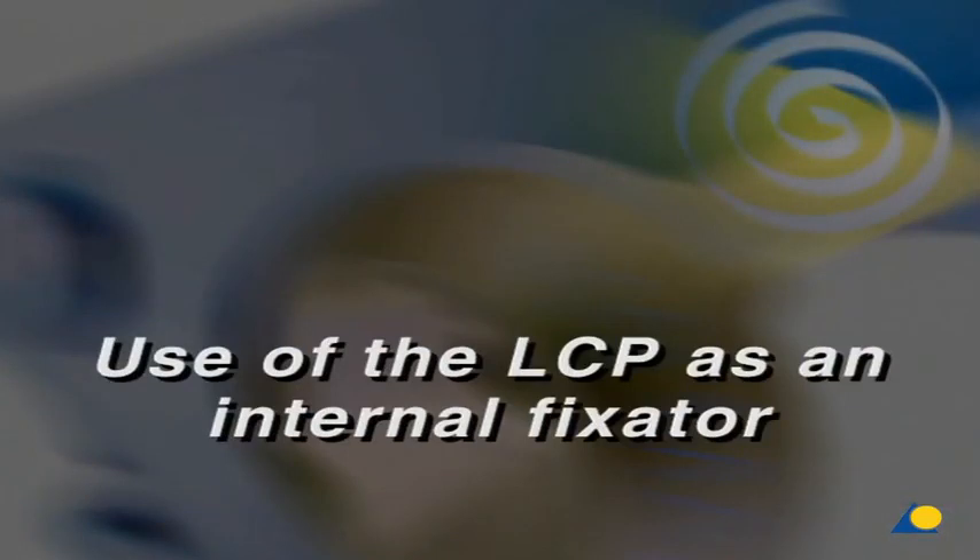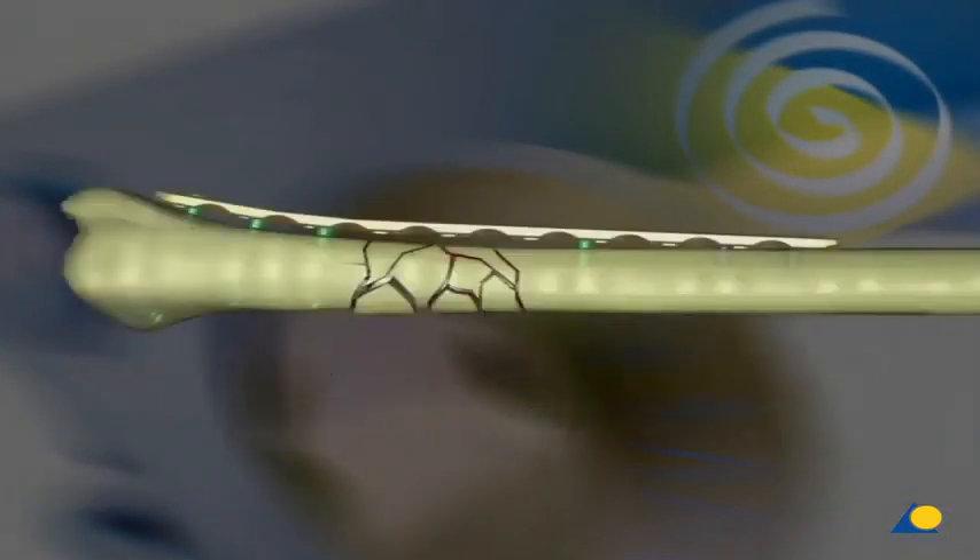Use of the LCP as an internal fixator. To do so, the plate has to be fixed with locking head screws only, and the fracture zone will not be touched but merely bridged. As shown, precise contouring of the plate is not necessary. Locking head screws can be inserted monocortically in the diaphysial zone of long bones.